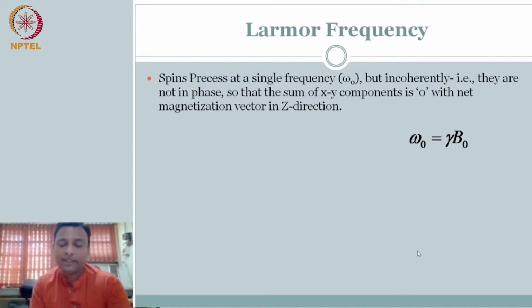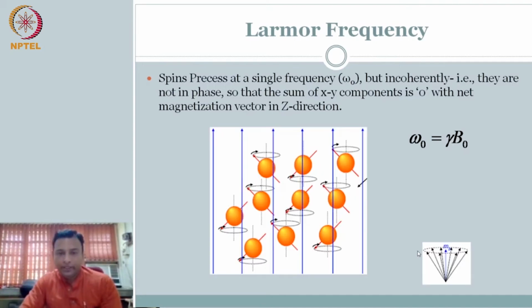So now you understand that when we talk about the magnetization vector, there is a net magnetization vector in the z direction, but if you are in all different phases, that is, if you don't make an extra effort, then there is still randomness in the xy direction, and therefore the component along the xy plane will go to 0, right? So let's put some images to explain.